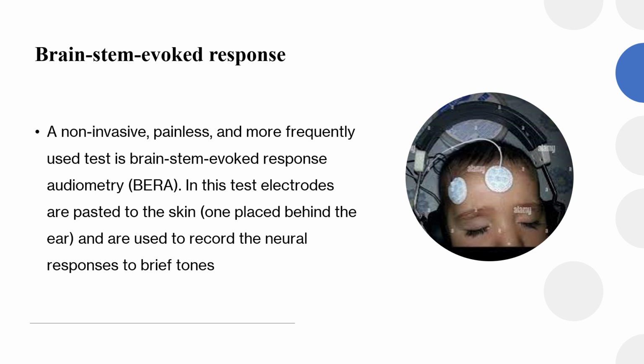Brain-stem-evoked response. A non-invasive, painless, and more frequently used test is brain-stem-evoked response audiometry, BERA. In this test, electrodes are applied to the skin, one placed behind the ear, and are used to record the neural responses to brief tones.